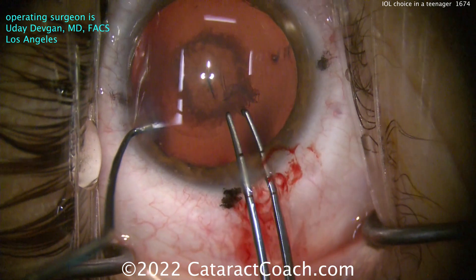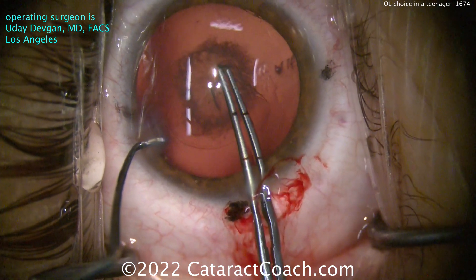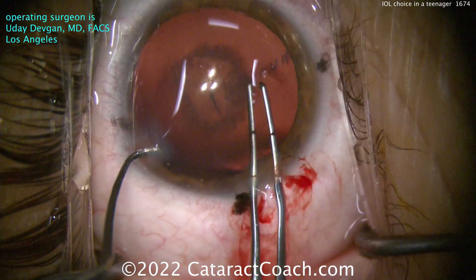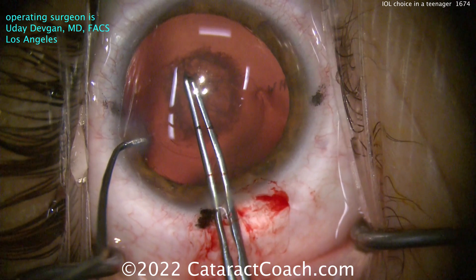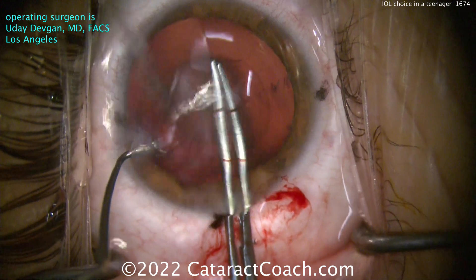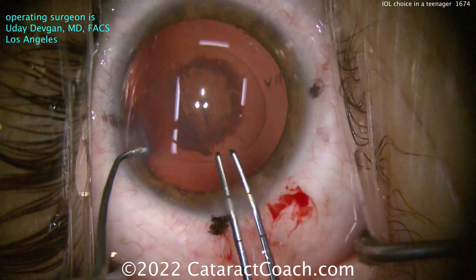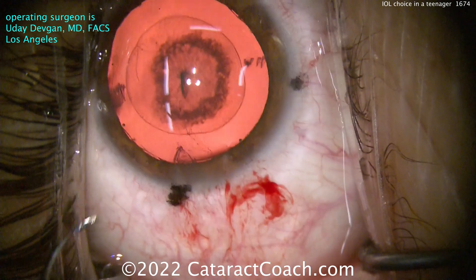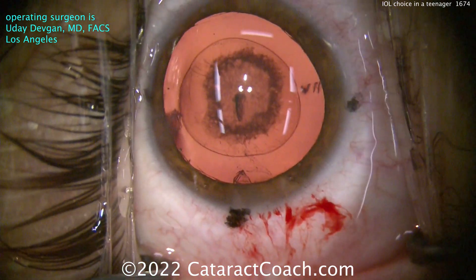We're getting the rhexis done. I'm holding the eye just in case the patient moves. It's a tough rhexis because it wants to run out. Look at the direction I'm pulling — remember, these young human lens capsules are very elastic. You can put trypan blue dye in to make them a little less elastic, but then they're also a bit more fragile, so there's a balance. I also want a good-sized rhexis — not a small one — because these young eyes are more likely to get PCO, capsule contraction, capsule fibrosis, and phimosis.